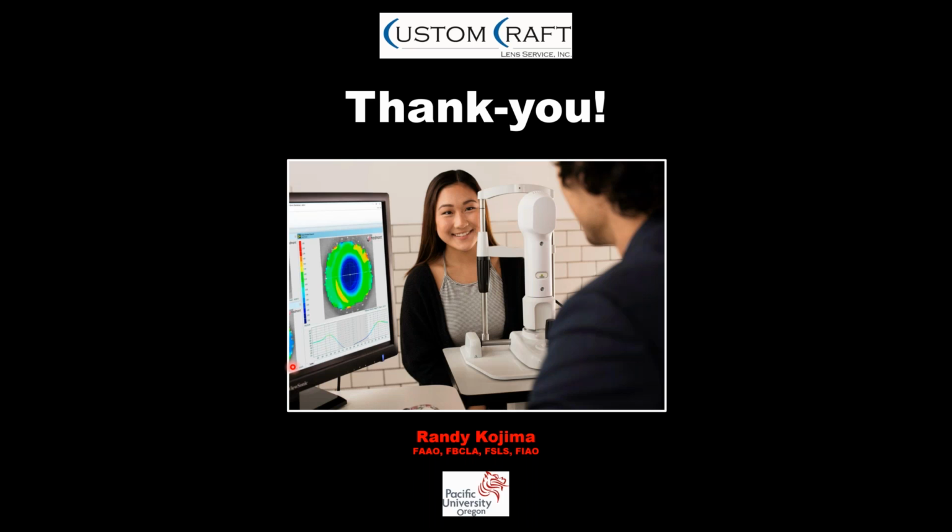The first question is, do you recommend any type of lubricating drop to use if you're having a difficult time getting a good map? Boy, that's such a great question, and it comes up with a lot of frequency. So obviously, people are paying attention to the fact that we're reflecting rings off that tear film, and I generally don't use artificial tear routinely because I don't want to load up the eye with fluid. I don't want to create, let's say, hills or mountains in the eye surface that aren't actually there. But definitely when we're struggling with a millisecond tear film breakup, it's really all you can do to try to smooth out the tear film.